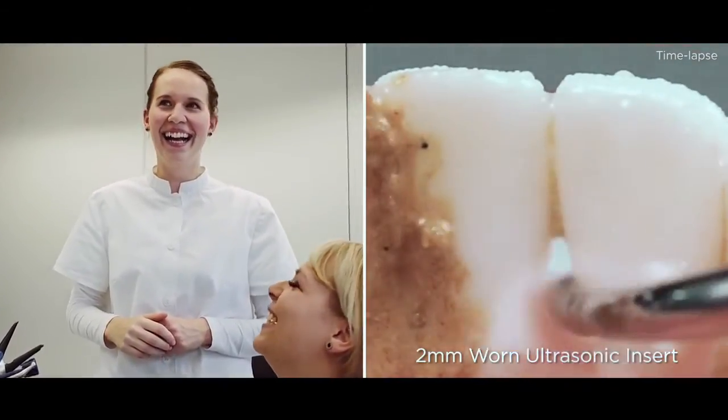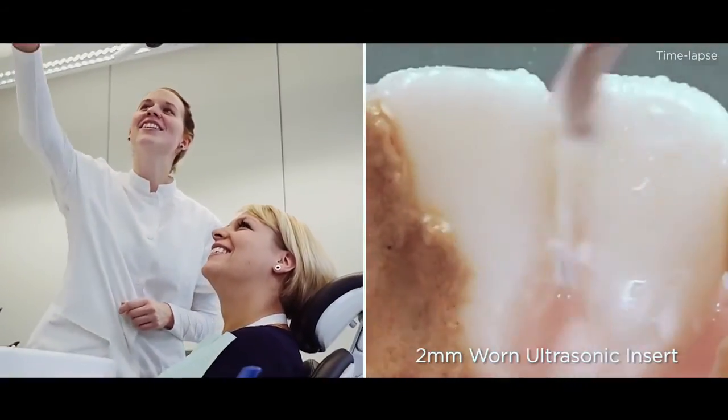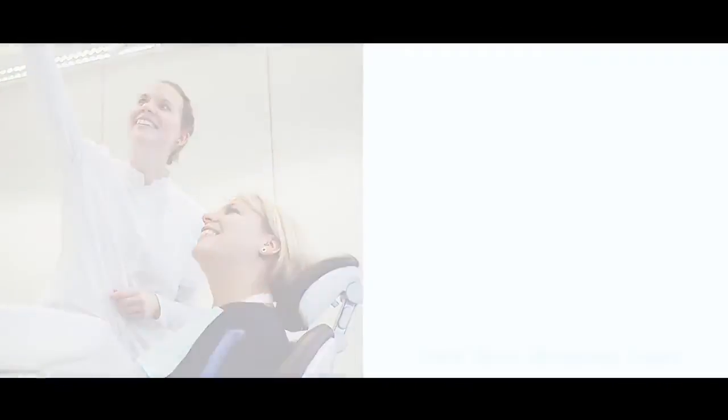What could you do with 30% more time? Check your inserts regularly to maximize efficiency and comfort for you and your patients.